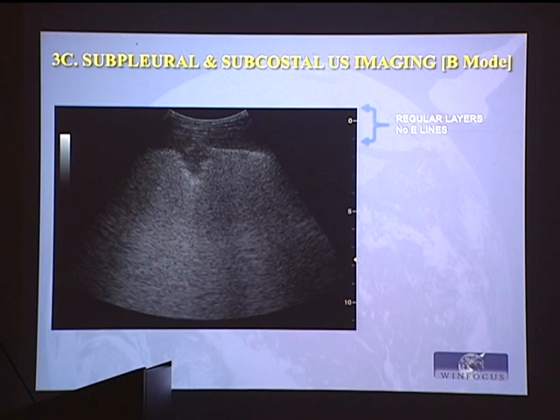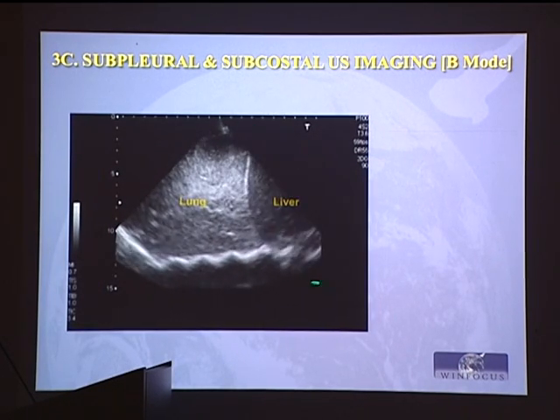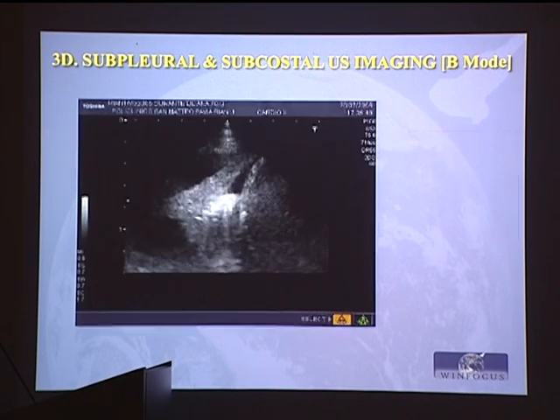You see the continuous A lines: pneumothorax or dry lung. Then B lines: disventilated or wet lung, merging B lines up to a white lung, severely disventilated and/or wet lung. And then if you have a lung full of water, it will become dark, hepatized, tissue-like. This is a fully consolidated lung, not just a little portion. And this is how the fluid will appear, okay?